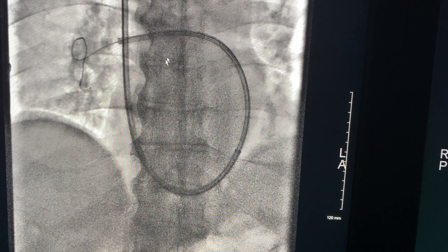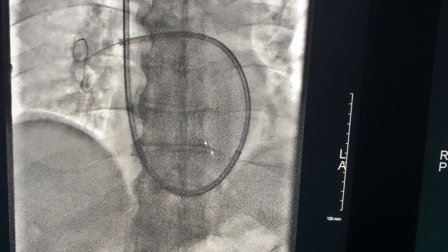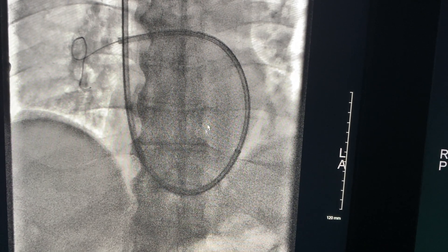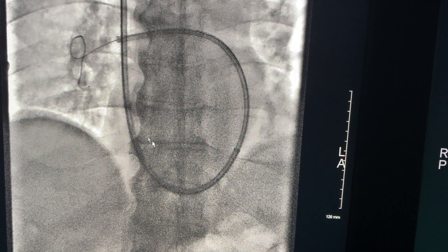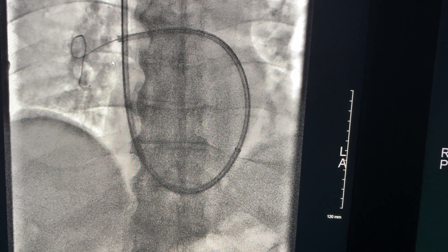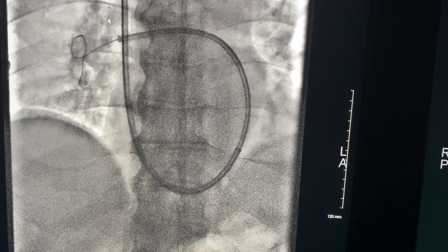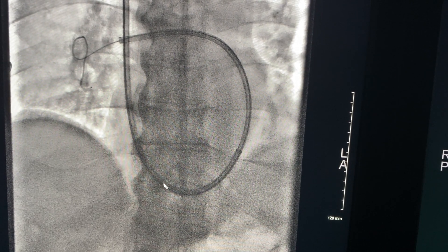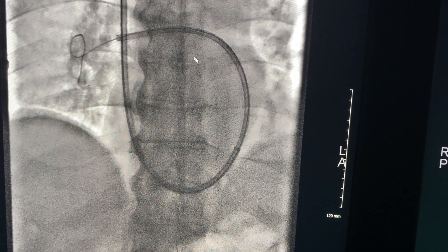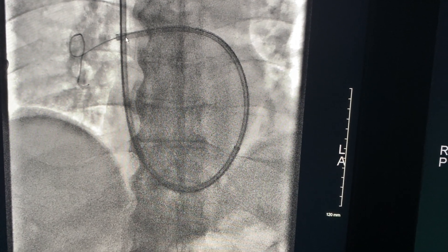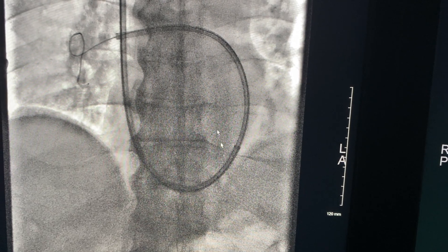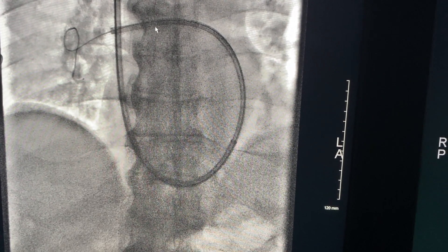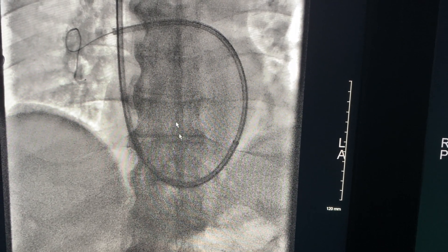In this image, we now see the wire — the thinner wire here — has crossed over into the heart and across into the right main pulmonary artery. This larger catheter is called the sheath; this is where the device is going to come through, and this is where we'll be able to actually take out a decent amount of clot.